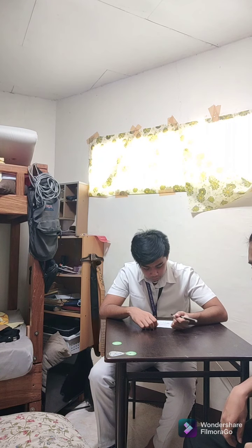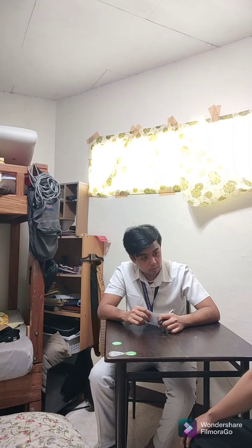Okay. So, confirm ko lang request form niyo sir is sa may scapula po. Sa may likuran ng banda. Sa right or sa left po banda sir? Sa right. Okay sir. So, kumusta po sir? Ano nangyari? So, last week din po bike. Okay. Then, since common din, pero yung na-crash po ako last week. Okay. So, masakit na po sa LS. Pero, sa right na po banda, wala na sa may left? Wala na po, sa right lang.